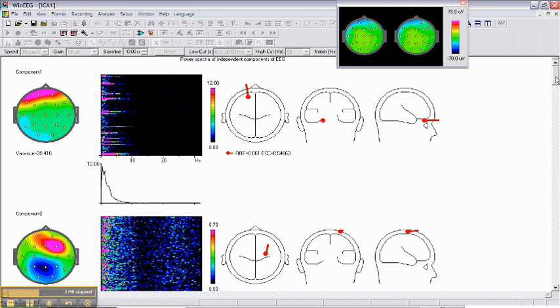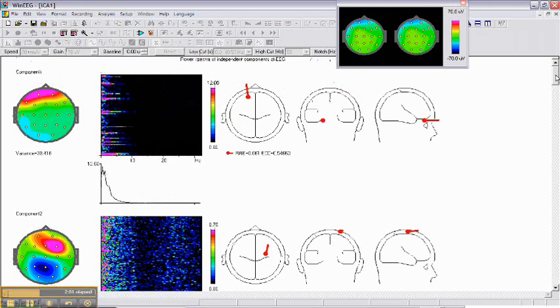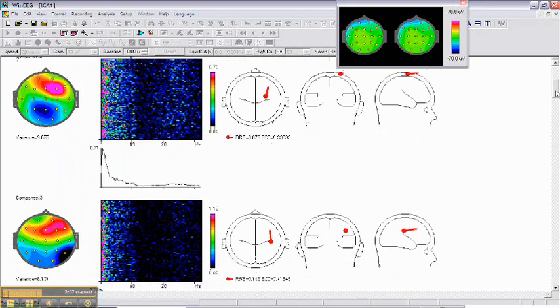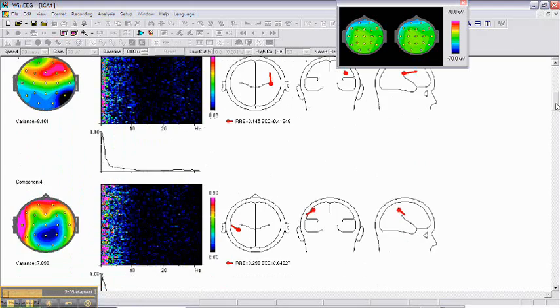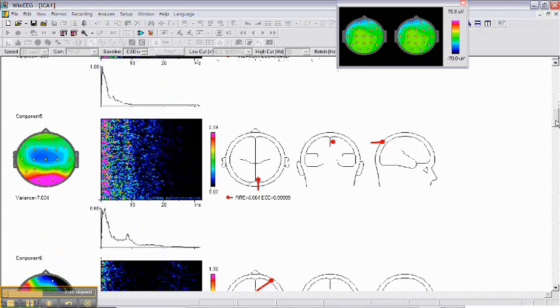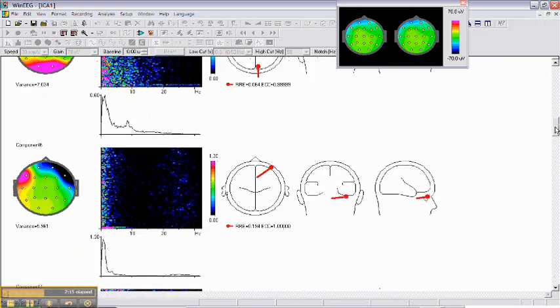Usually it takes about 100 iterations to perform the ICA decomposition. So now we have ICA components and the first one is simply eye movements, eye blinks actually.